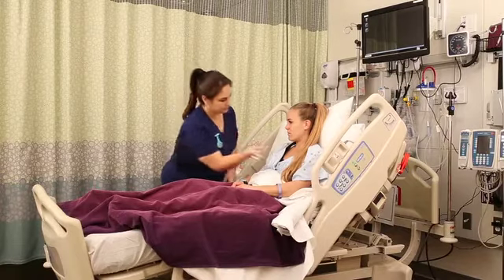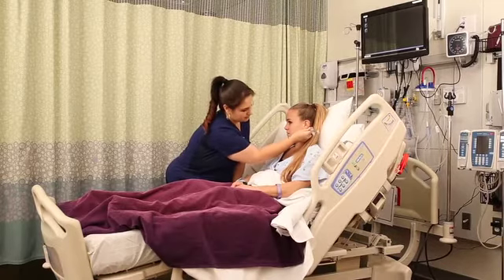Next, we'll do the Rinne test. Strike the tuning fork and place it on the mastoid process behind the ear.